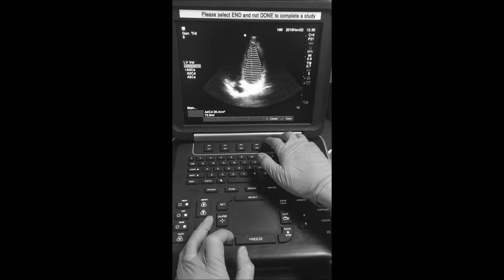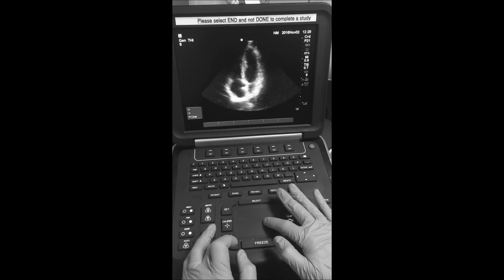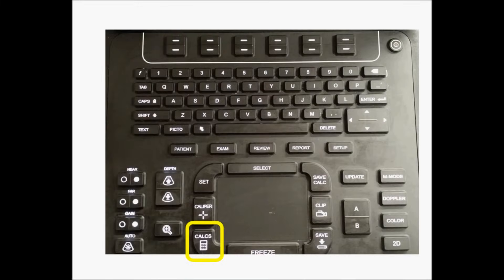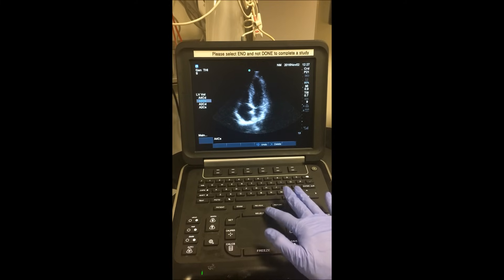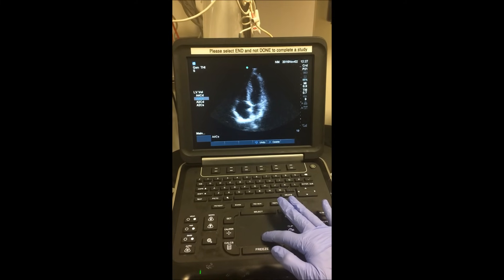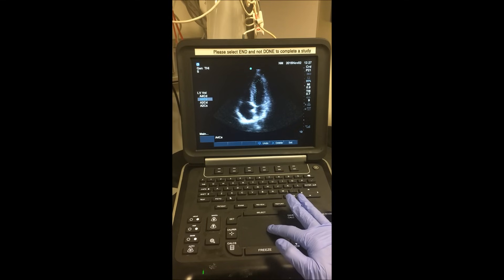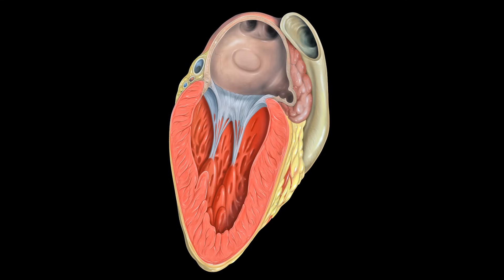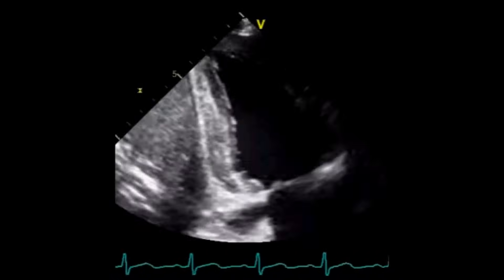We then press CALC to return to the frozen images and scroll through until we find end systole, where the left ventricular volume is at its minimum size. We again select CALC and repeat the process, this time selecting the apical four-chamber systole option, tracing the ventricle annulus to annulus, and pressing SELECT and save. This brings up a calculated ejection fraction on the screen. Accuracy of the Simpson method improves by also adding measurements from the apical two-chamber view, which can be incorporated once the operator learns how to obtain it.